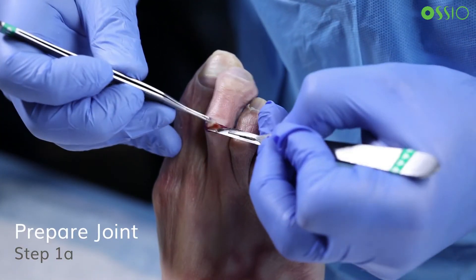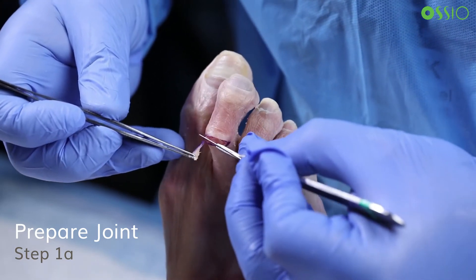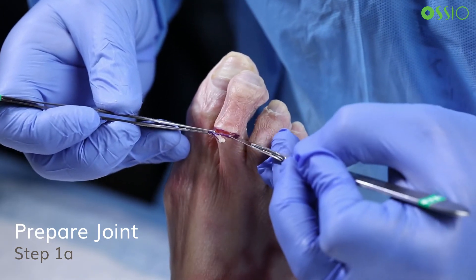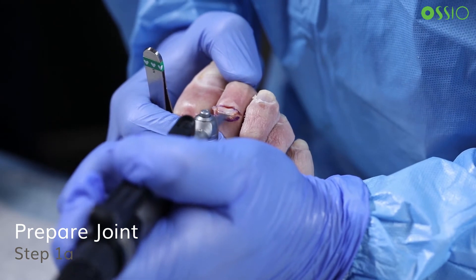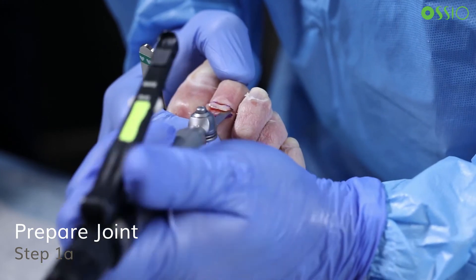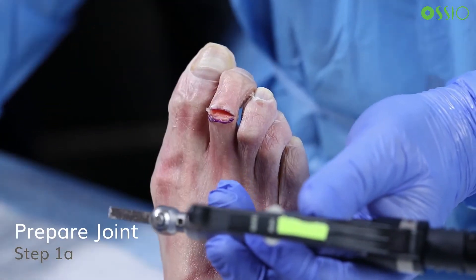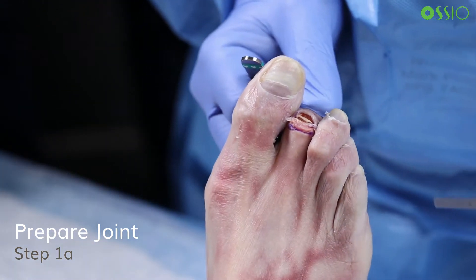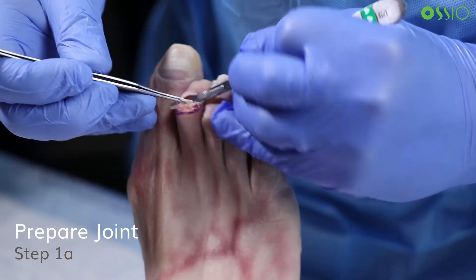The first step is to expose the joint. Either a longitudinal or transverse incisional approach can be considered. The soft tissue structure should be circumferentially released from the PIP joint, including the plantar capsule. Then resect both sides of the PIP joint parallel to the joint surface using a small oscillating saw. Approximately one to two millimeters of bone should be resected from the head of the proximal phalanx and base of the middle phalanx to minimize shortening of the toe and enable a tight fit of the barbed implant to maintain reduction during the healing process.